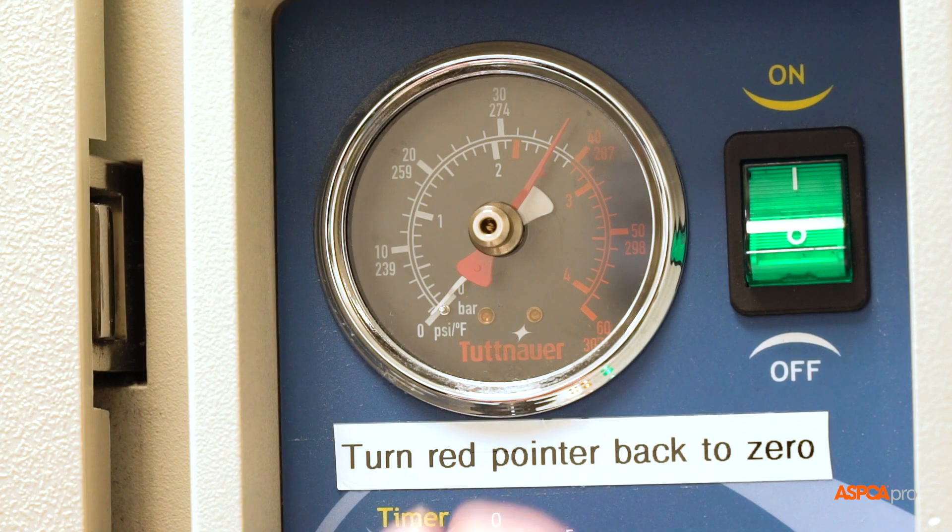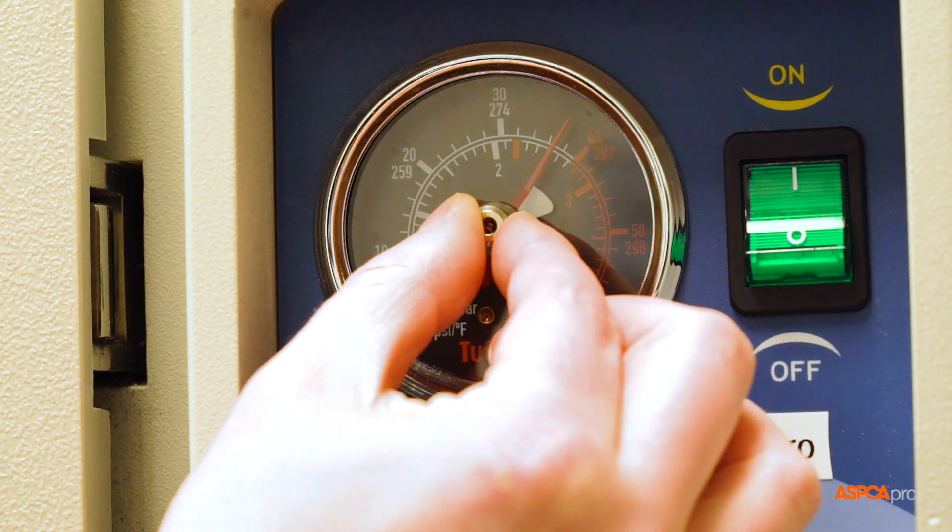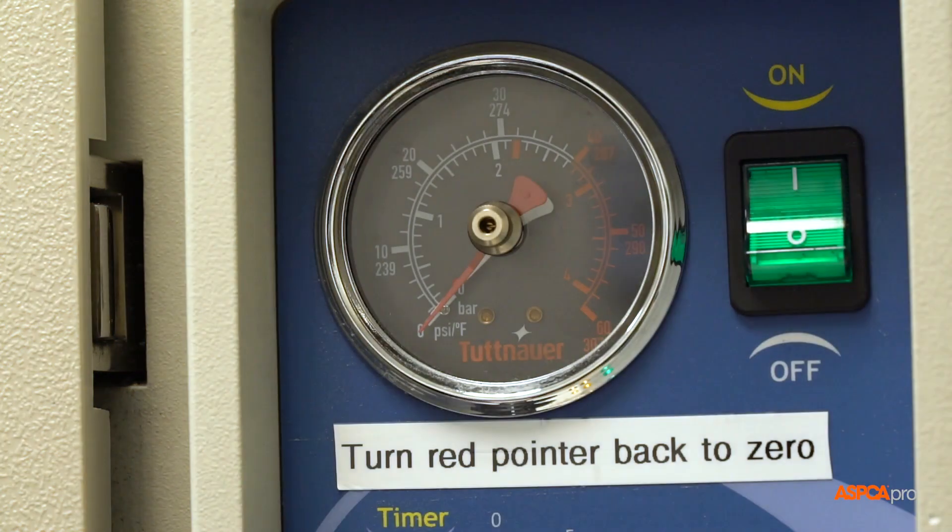Next, ensure the red pointer in the pressure gauge has been turned back to zero, as it will not automatically reset.